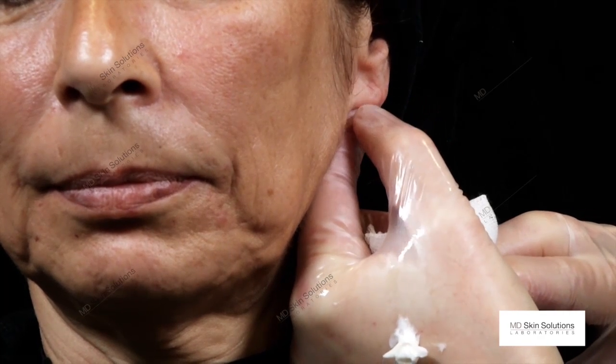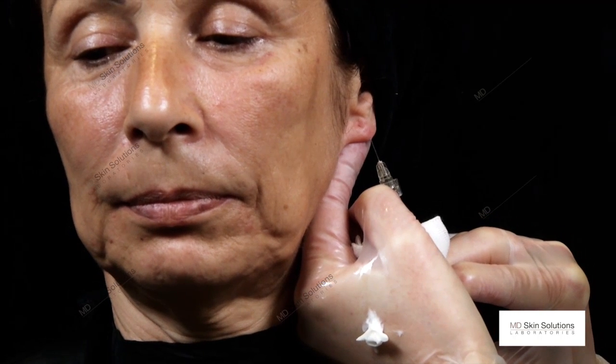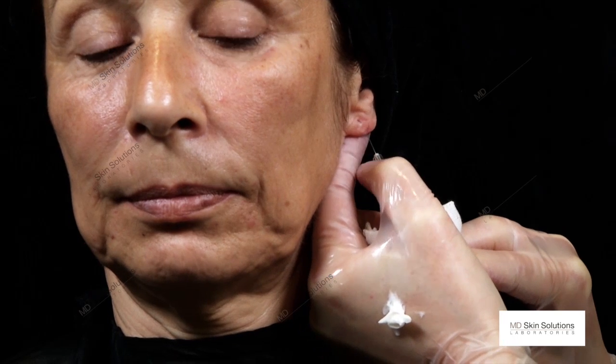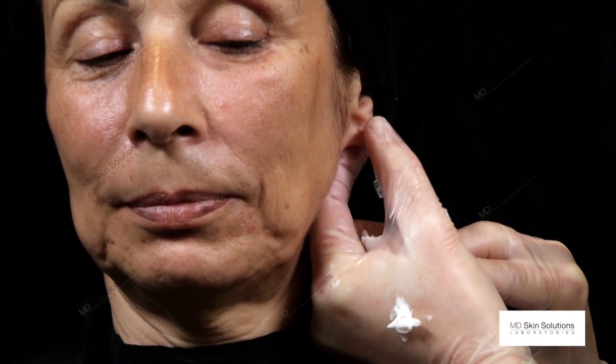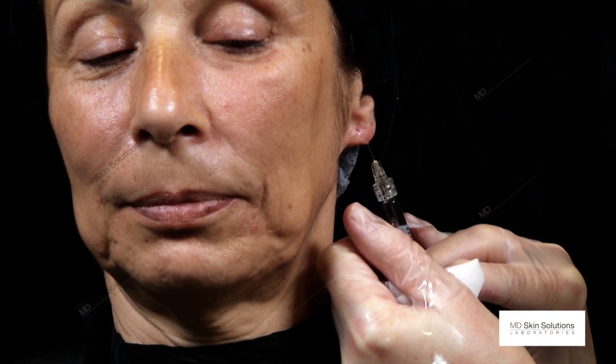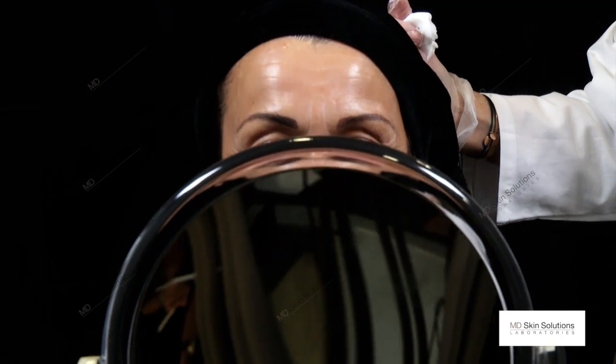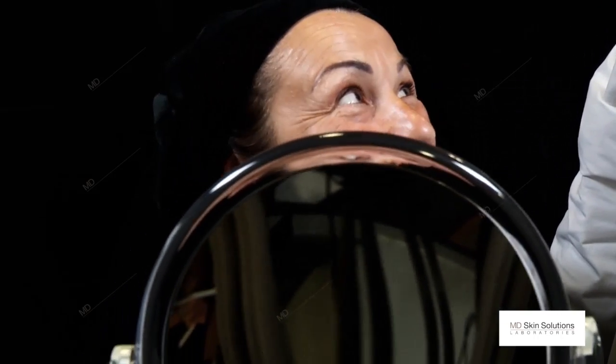Don't do many entry points because earlobes do bruise a lot. Now I use 0.4 of Pluryal on both sides. Tournez la tête. Parfait. Merci.